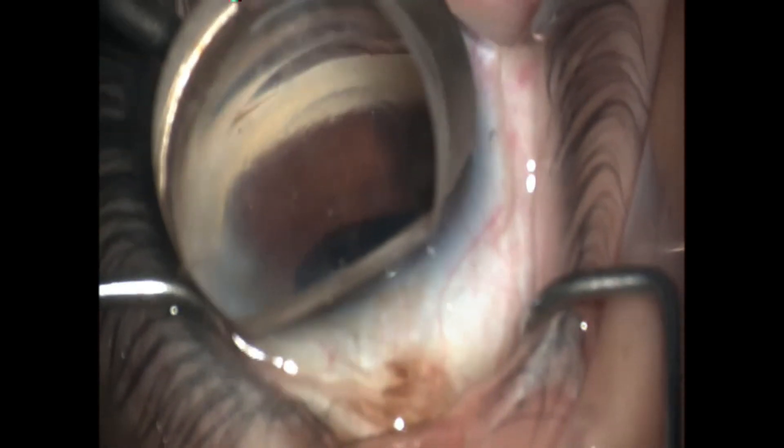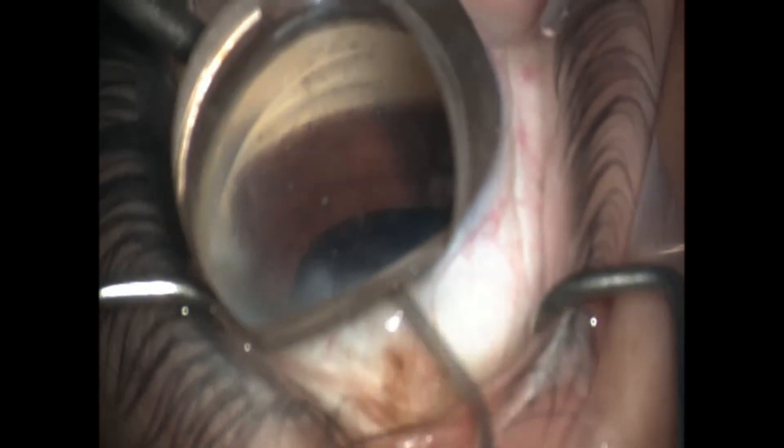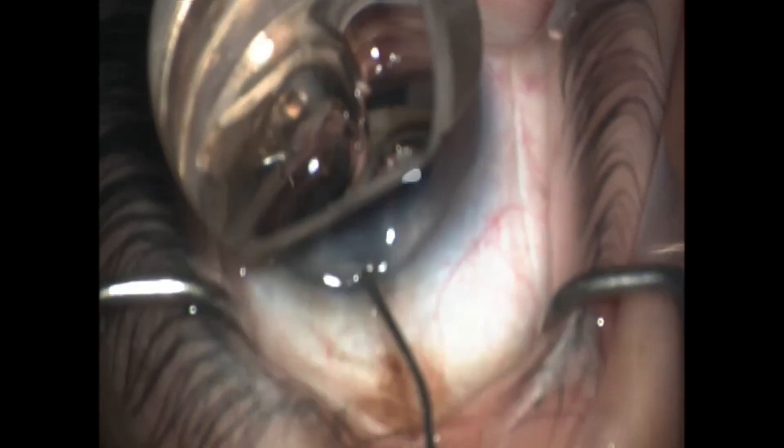Most of the time it's a hard view when you try to see the lateral stents. Here when I injected that second stent, I felt like I didn't get quite the injection I wanted.